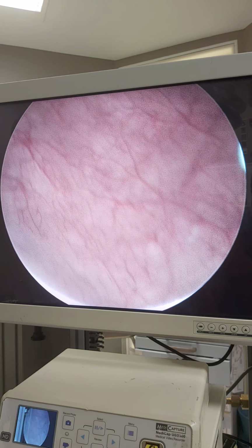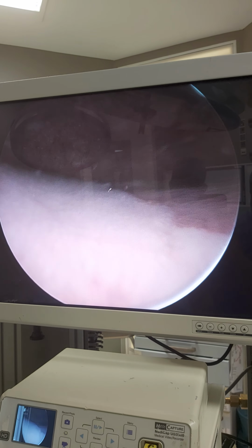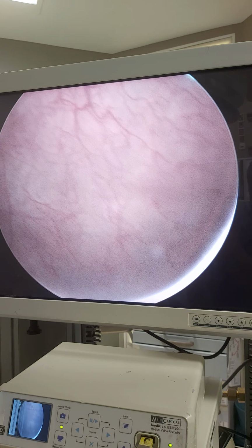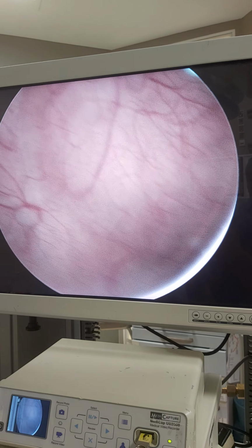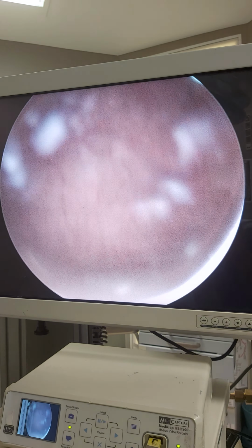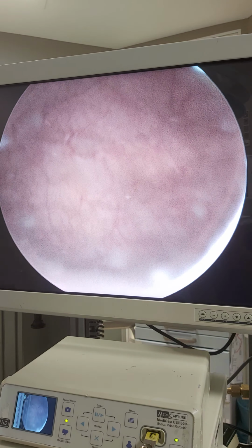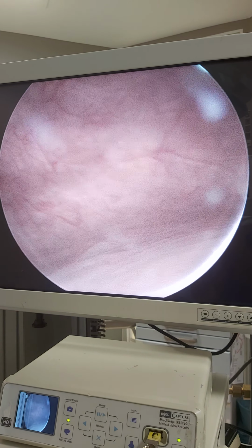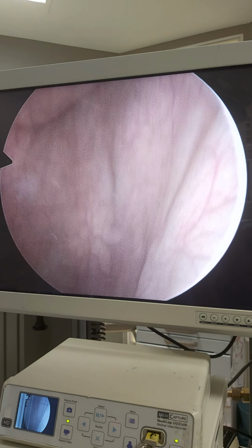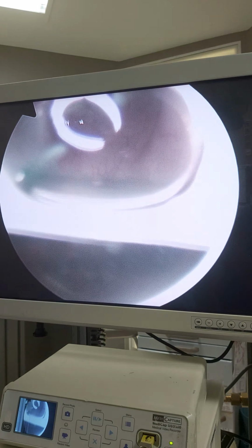My main theory is that using too much antibiotics heal these tissues, at least the superficial part, but they change the bladder flora and bladder walls, and all the bladder walls are inflamed. In this case, although there is a big leukoplakia here, there is no infection in this opposite bladder wall, no inflammation. It's not disseminated. At the end of the procedure, we will understand better how much the side walls, bladder walls will be affected, but until now it seems quite alright.